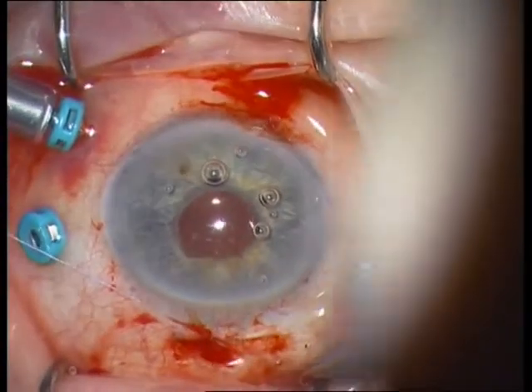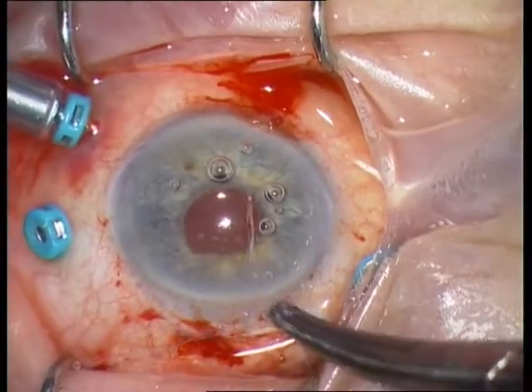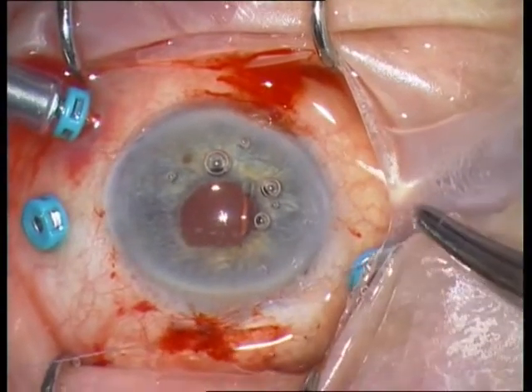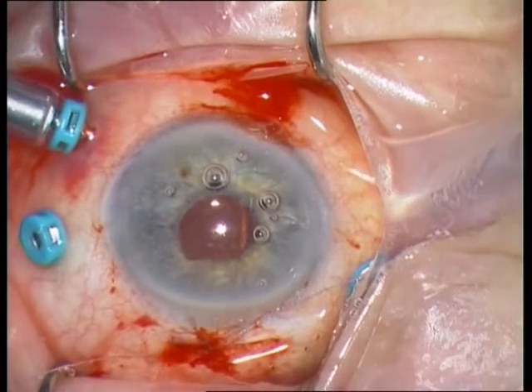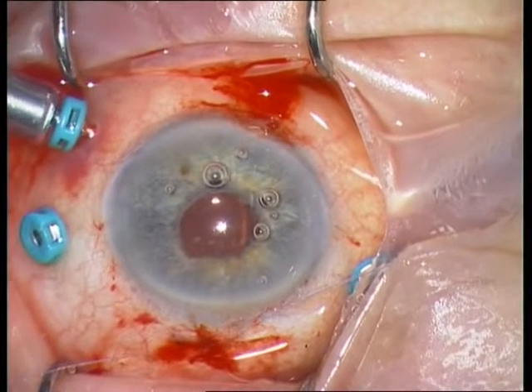Don't pull strongly — the stitch must only be form-stable so that the incision is watertight. Don't pull too strongly in order to avoid astigmatism.